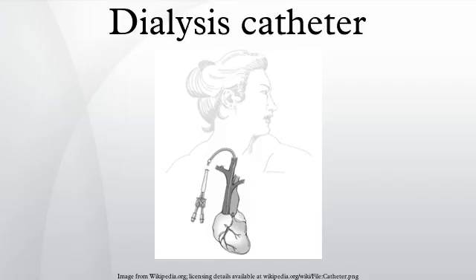Complications: some common malfunctions of dialysis catheters include clotting, infection, and kinking. One of the most common errors of tunneled hemodialysis catheter insertions is failure to locate the arterial limb of the catheter medially and the venous limb laterally. This must be done because most catheters have a memory in the plastic, which will cause the catheter to try to resume its natural straight form.